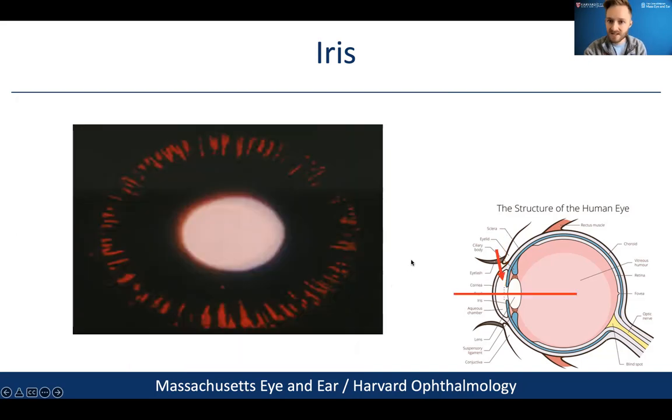There's also a unique feature of a slit lamp. And the way I think about this before you look at this picture and get too invested is, if you've taken pictures of people with your phone or a fancy camera, but then they have this red glow of the eyes, like a red light reflex. Well, that's exactly what's happening here when we point the light directly into the eye, facing the patient, and it's having the reflection come directly back at us. Again, we're focused on the iris, but this is called retroillumination.